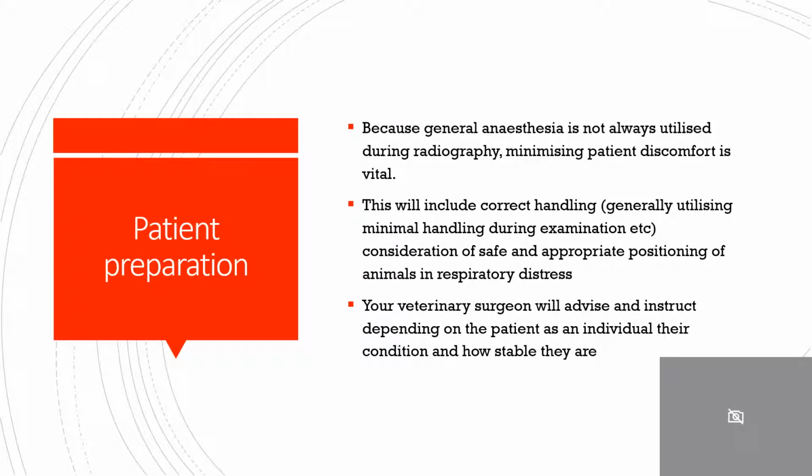Patient preparation continued. Because general anaesthesia is not always utilised during radiography, minimising patient discomfort is vital. This will include correct handling, generally utilising minimal handling during examination, and consideration of safe and appropriate positioning of animals in respiratory distress. Your veterinary surgeon will advise and instruct depending on the patient as an individual, their condition and how stable they are.